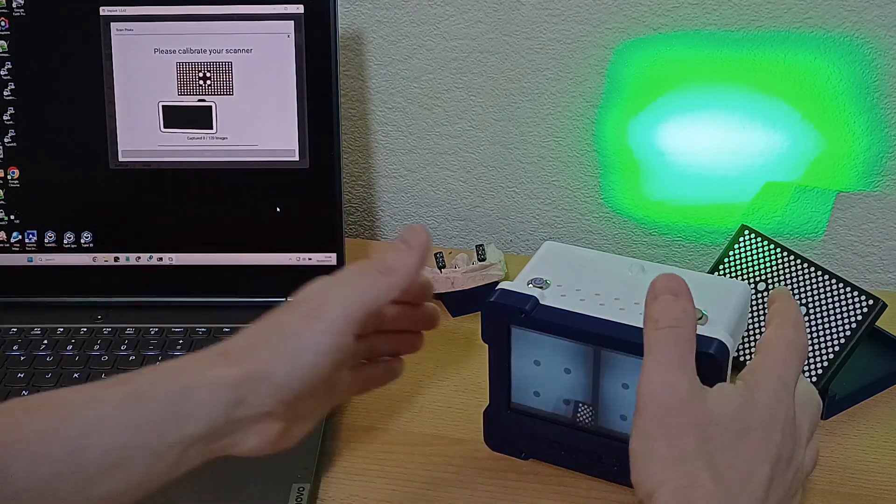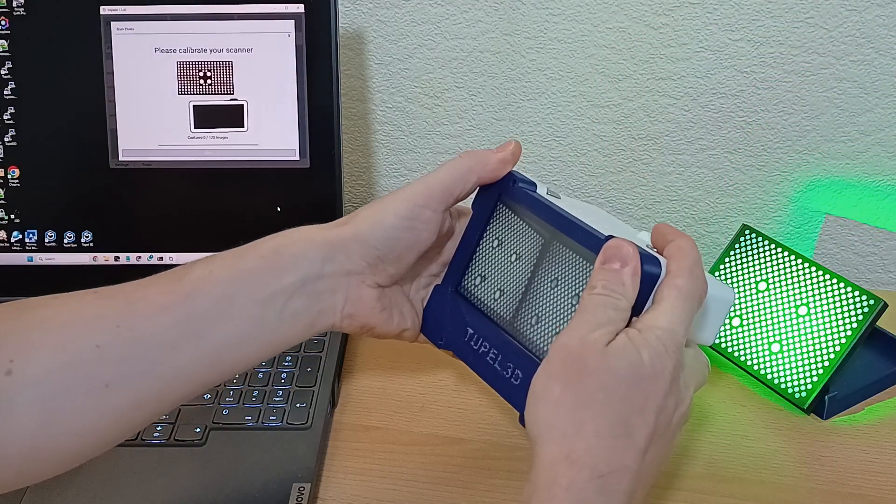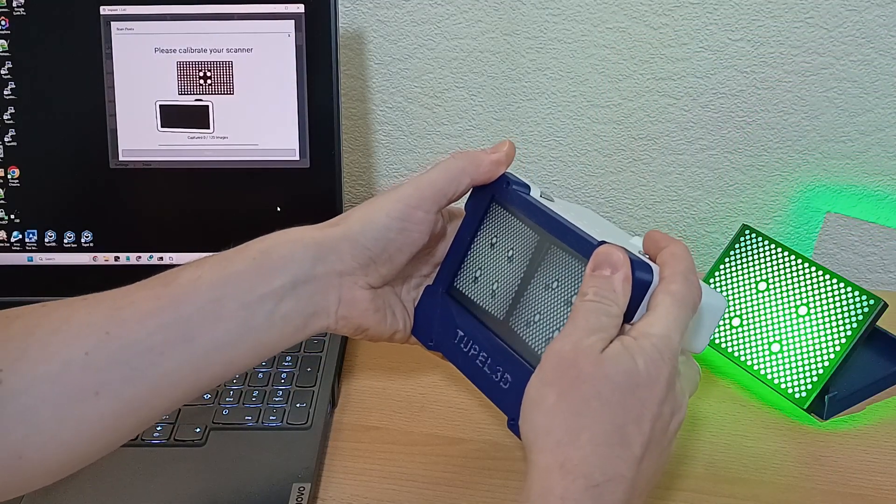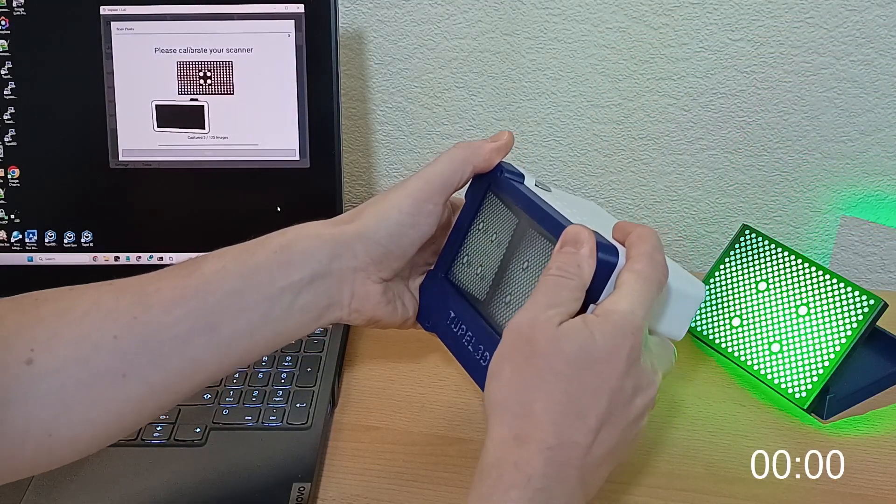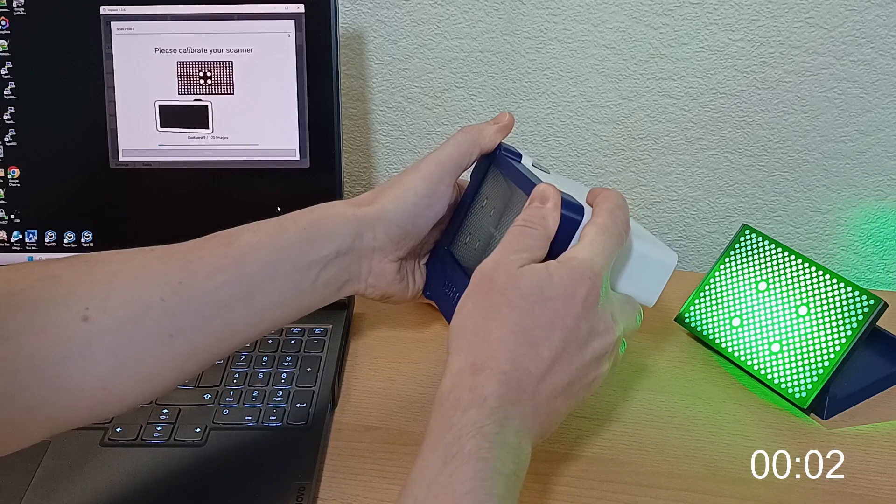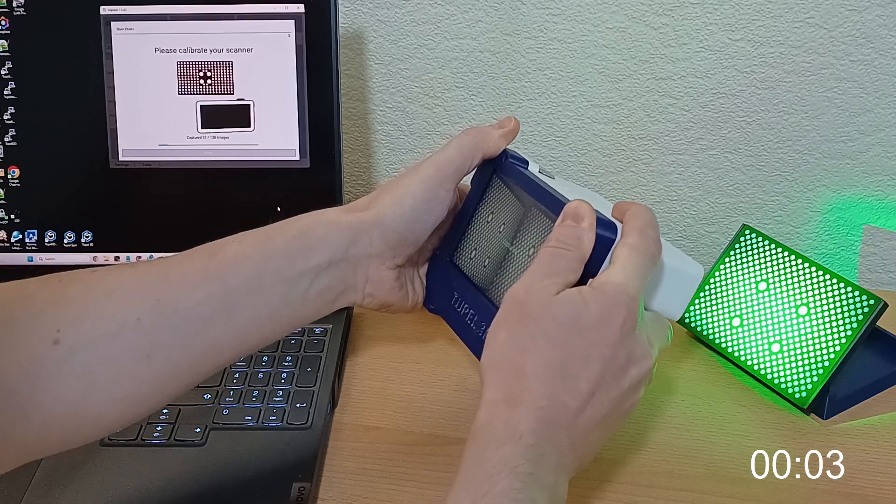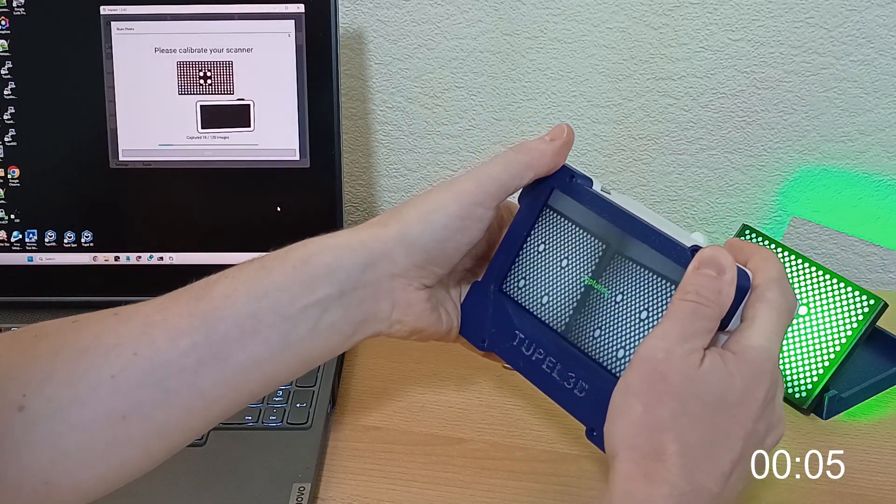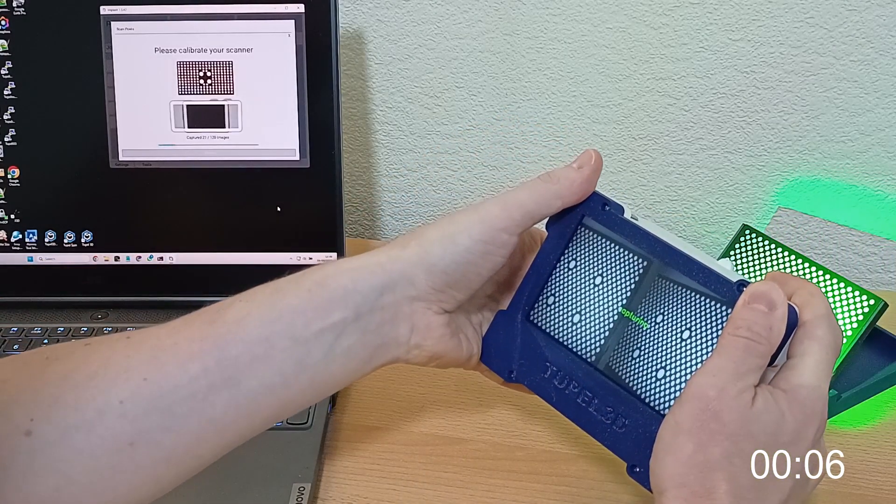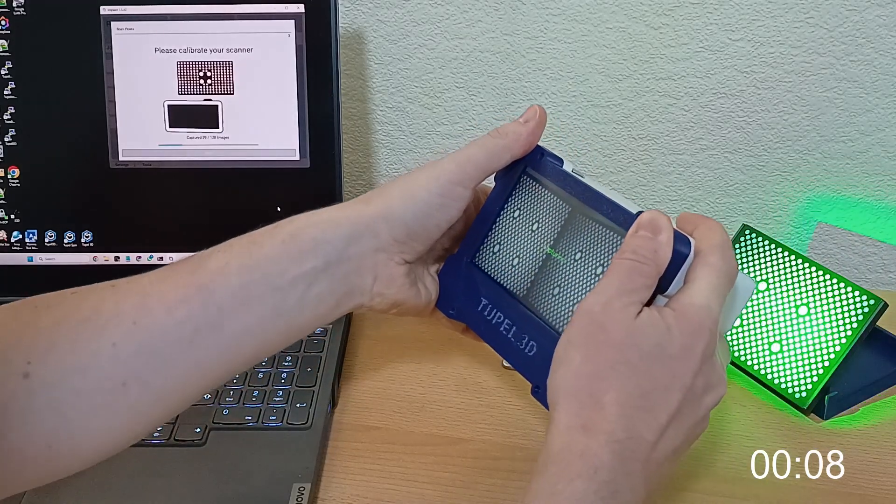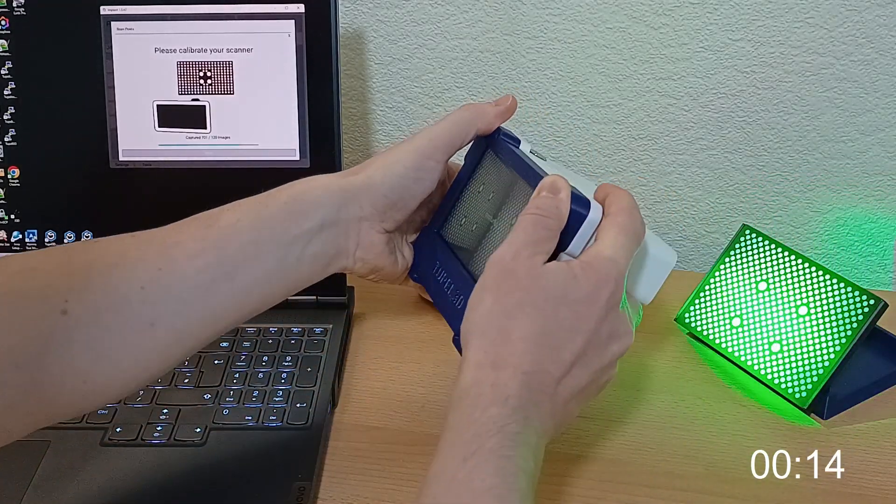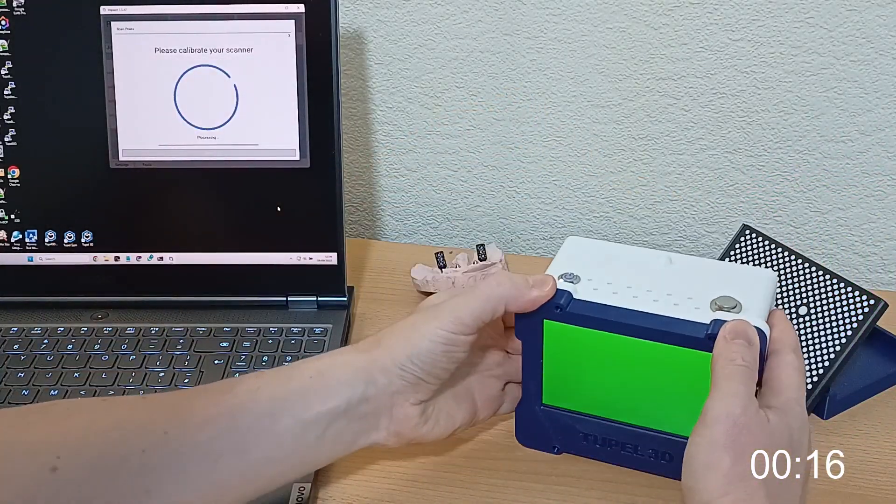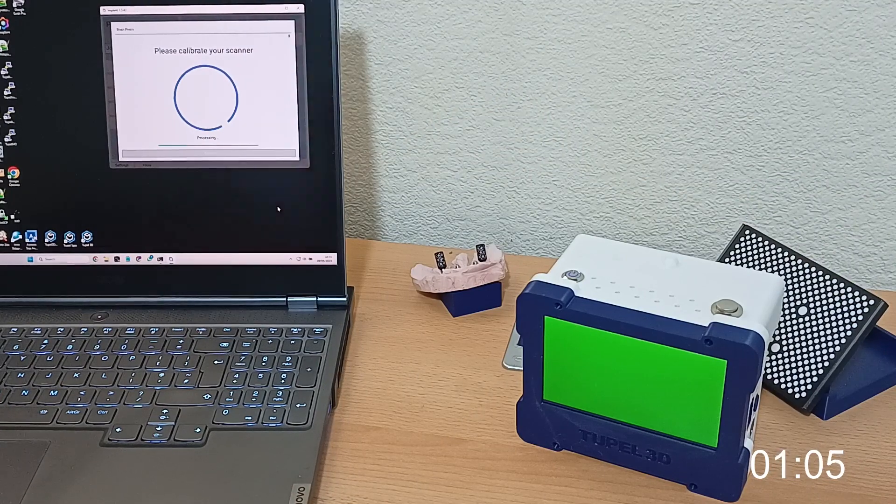It realizes that the scanner hasn't been calibrated recently, so it tells us to do a calibration. This means we have to point the scanner at the calibration plate, hold the capture button, and move the scanner from side to side. I've accelerated the video to save your time.